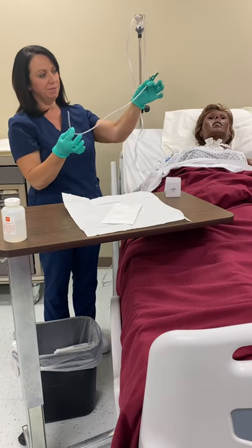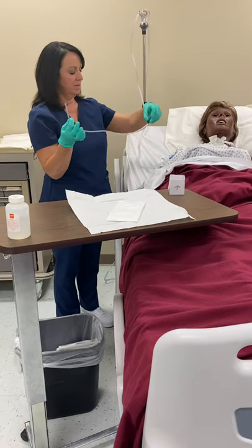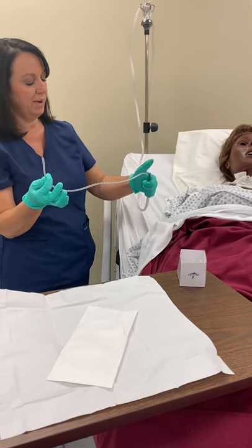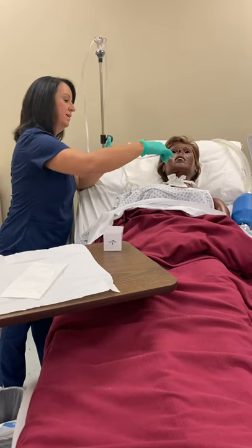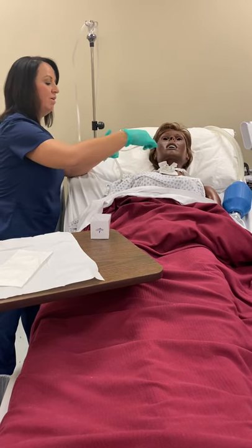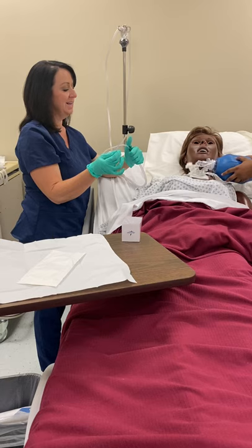I'm going to contaminate my left hand — this is going to be my dirty hand with the Y-cord. I'm going to hook that up to suction and we're going to get ready to make our three passes. Here we go with the first pass: I'm going straight down, sucking with intermittent suction on the way out. Each pass should be quick — 10 seconds or less.